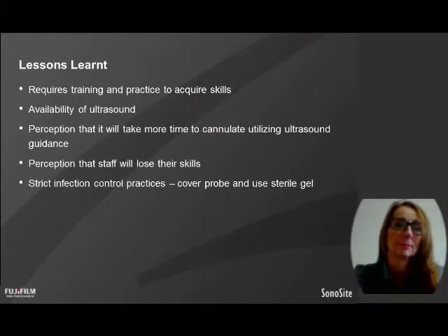Once you do get that confidence and competence, what I find is that there's never enough ultrasounds to go around, because people do quickly discover that the ultrasound improves their abilities, their skills, reduces infiltrations, reduces patient distress and staff distress. And very quickly staff and patients like to have the ultrasound available and usable, particularly in difficult cannulations.